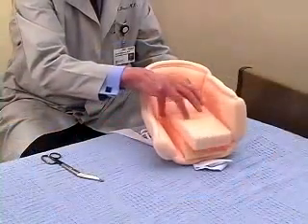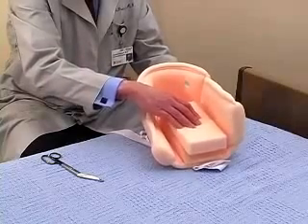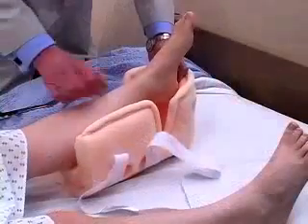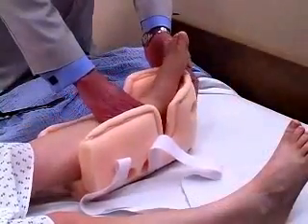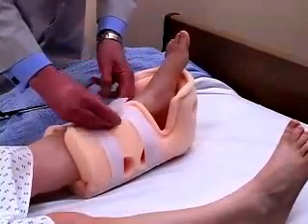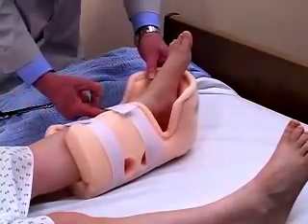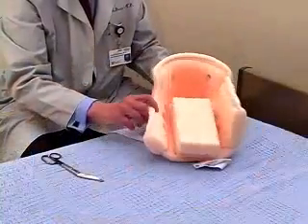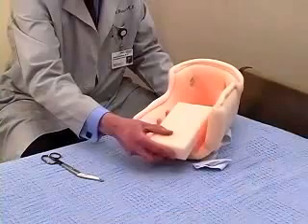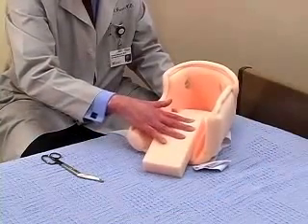For patients of a bariatric size with large, heavy legs, the spare pad may be placed on top of the fixed pad. Again, the heel is placed deep within the boot and the straps applied. Note that even in this situation, there is room between the straps and the legs. For very tall patients, where you need to distribute the pressure over a much longer area, position the pad away from the heel of the boot.